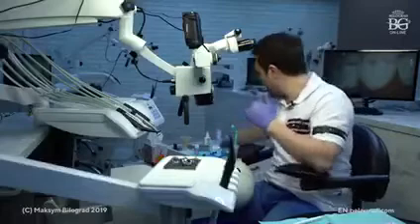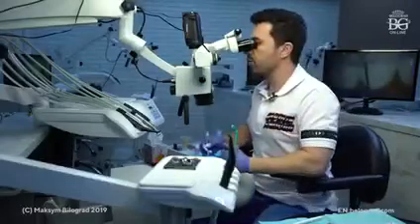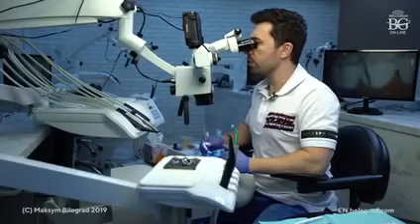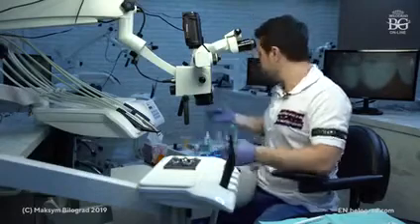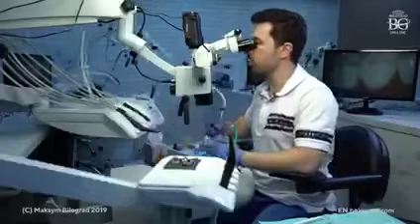In our case here, I will not use my retraction cord because you see that the gum, the sulcus here is pretty deep. But I will just prep a little bit before the gum just to show you finish lines.